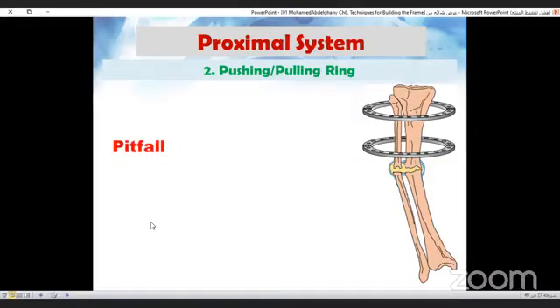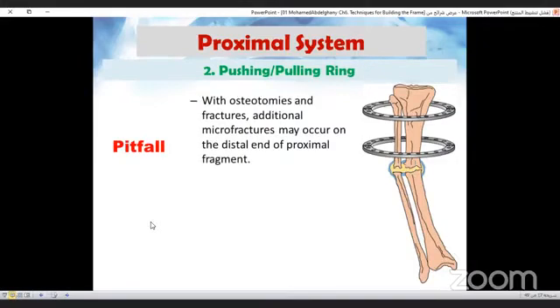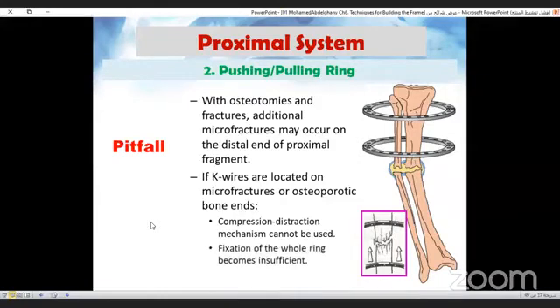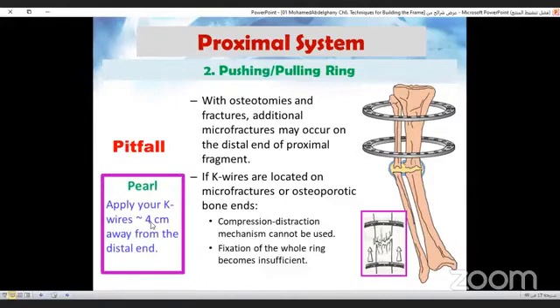However, microfractures at the distal end of the proximal fragment may be present. So if we apply K wires to these microfractures or osteoporotic bone ends, compression distraction mechanism cannot be used and fixation of the whole ring becomes insufficient. Thus, you must apply your K wires about four centimeters away from this weak zone.